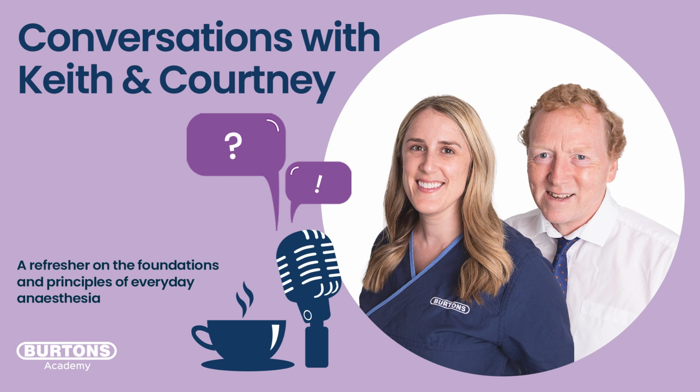You can't. But what you can rely on is that across the species, from mice to horses or even elephants, the range is pretty limited. Your mouse is going to be ventilated happily at 5 or 6 centimeters of water pressure, and your horse is going to be happily ventilated at 20 to 25. Now that's only a range from 5 to 25 for something that weighs 30 grams to something that weighs 500, 600 kilos. So we haven't got a lot to play with. So it becomes reasonable to make some initial assumptions, as starting points.